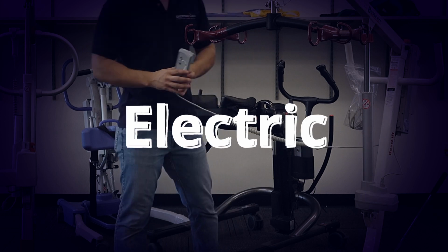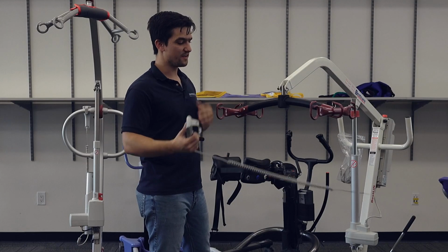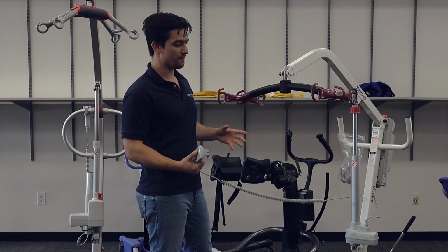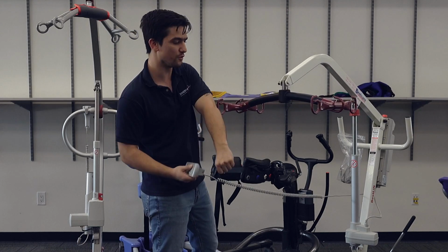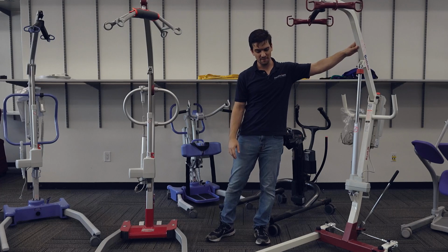So with an electric patient lift, you have a hand control. With this hand control, we're able to be here by the individual while we're raising or lowering. The benefit of this is that we're able to grab onto the user and the sling if we're going into a wheelchair or a bed, and this way we're able to lower them in the proper position. It's important to use a personal lift because you don't want your loved ones or your caregiver to develop a bad back.